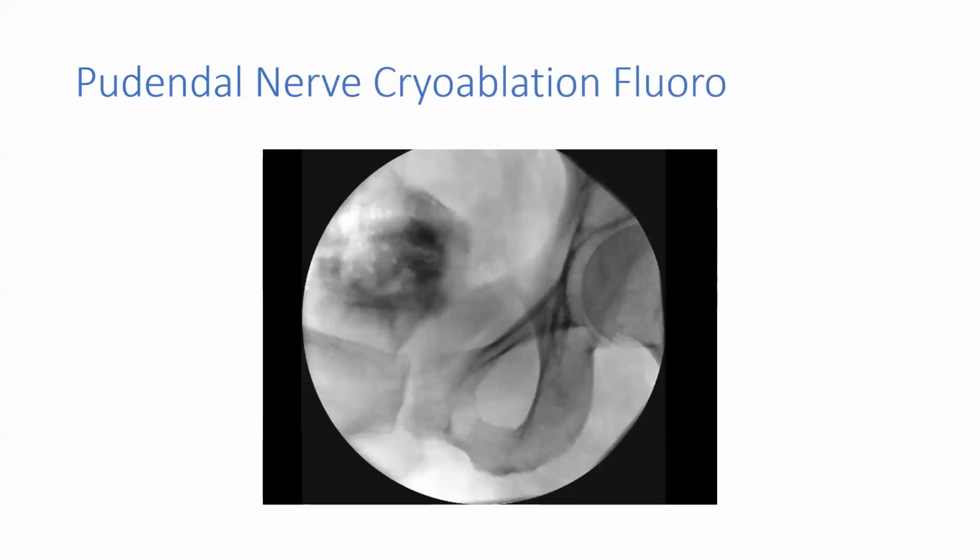So this is a picture of the ischial spine, this structure. Typically, you need to do a caudal tilt and you oblique it until you can see that triangle. This is the ischial spine. And this is typically your target, where the pudendal nerve runs, where my arrow is.